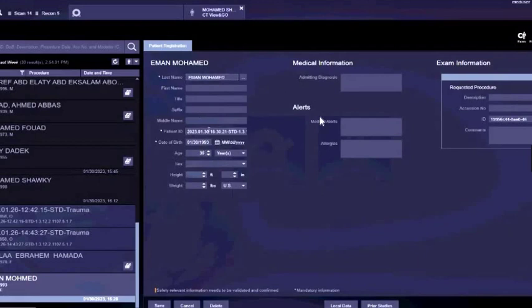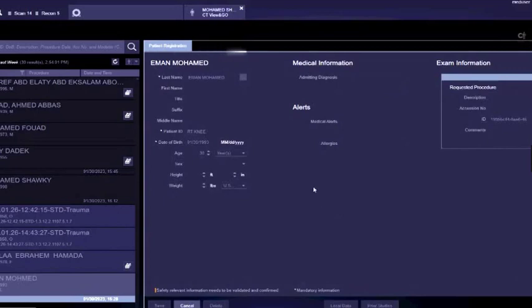After that, in the patient ID, you can write the patient number or the part that we will do the scan for. After that, write the patient age. Press next. In the next page you will find the protocols of CT.